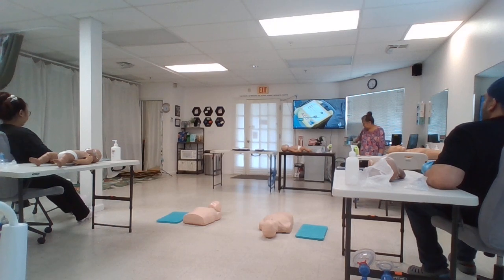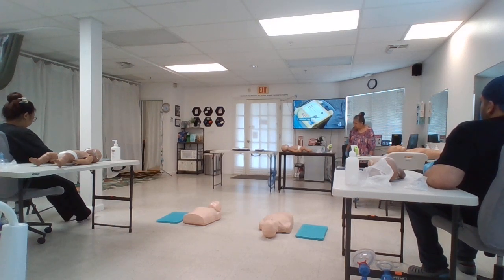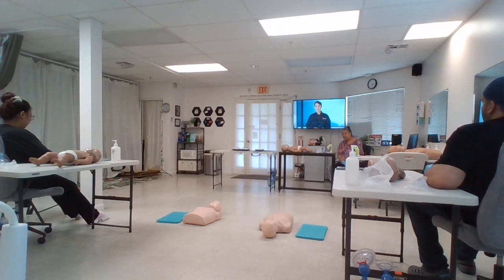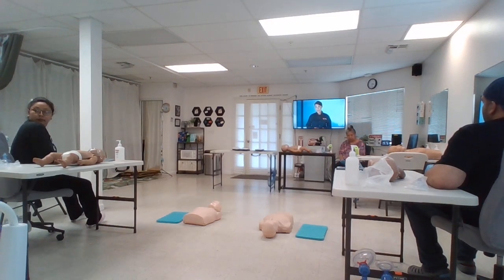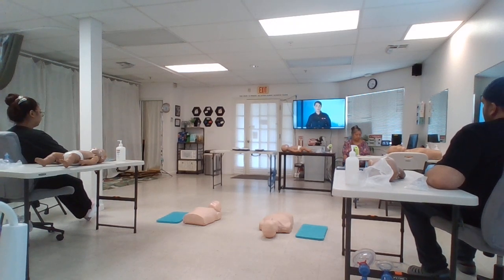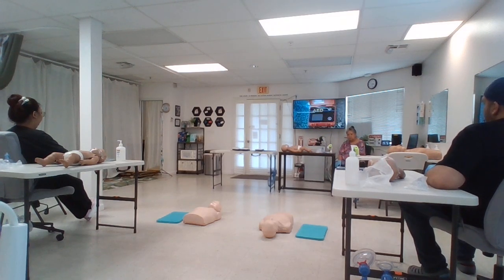In this section, we will cover use of an AED and a bag mask device. AEDs vary according to the model, but all operate in basically the same way. You must be familiar with the AED used in your particular setting. The 4 universal steps for operating an AED are as follows. Power on the AED and follow the AED prompts.